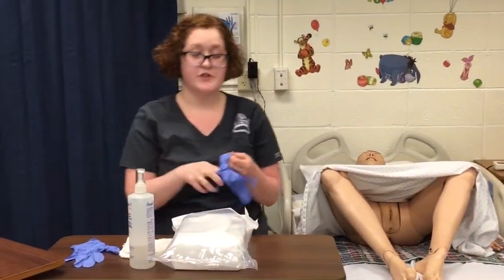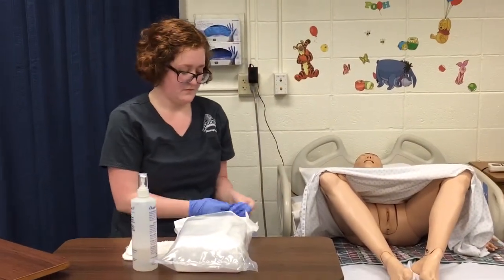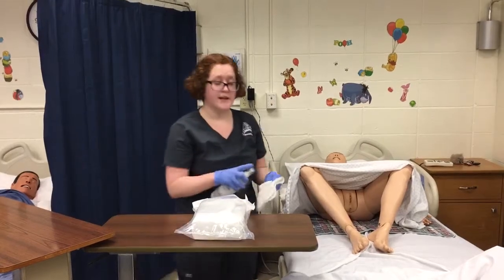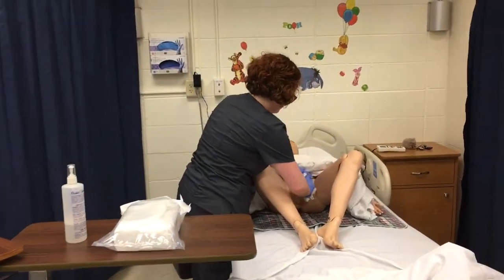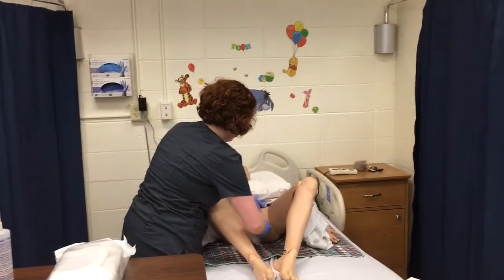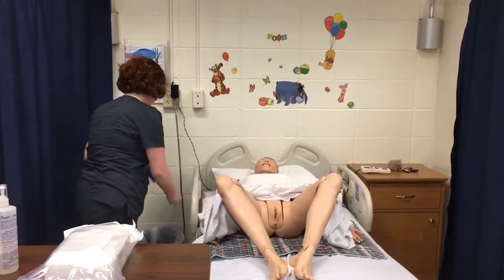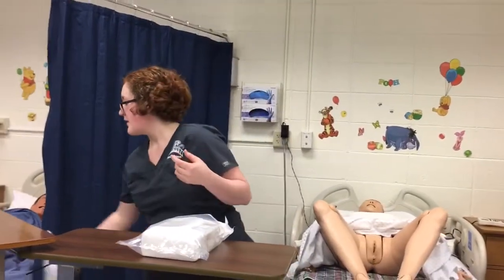After hand hygiene, I'm going to put on my clean gloves and perform perineal care. Then I'm going to throw that away, take off my gloves, perform hand hygiene again, and then I'm going to open up my sterile kit.